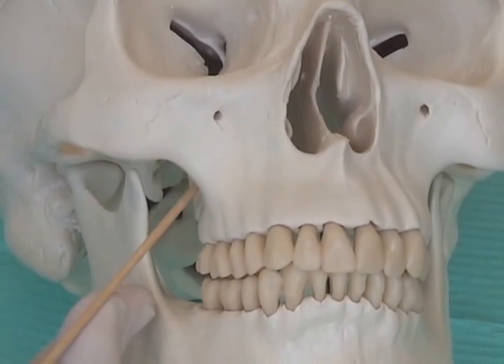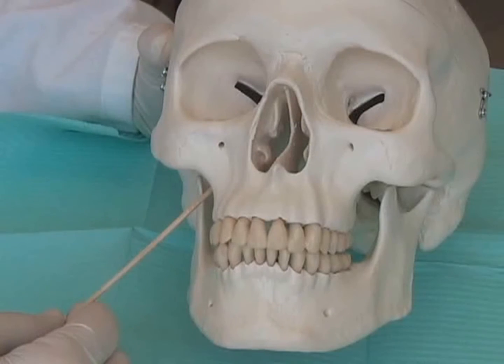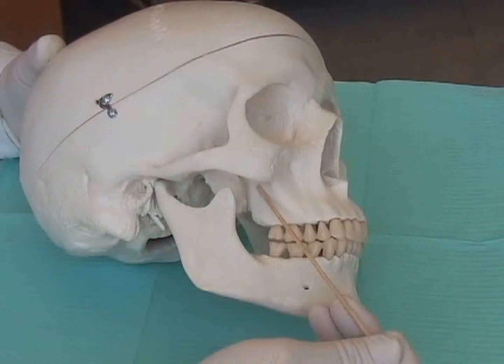The target area for the needle tip is above and behind the second maxillary molar. Direct the needle towards the mid-sagittal plane at a 45-degree angle while simultaneously directing it superiorly at a 45-degree angle to the occlusal plane. The intraoral landmarks for this injection are the zygomatic arch, the height of the maxillary vestibule, and the second maxillary molar.